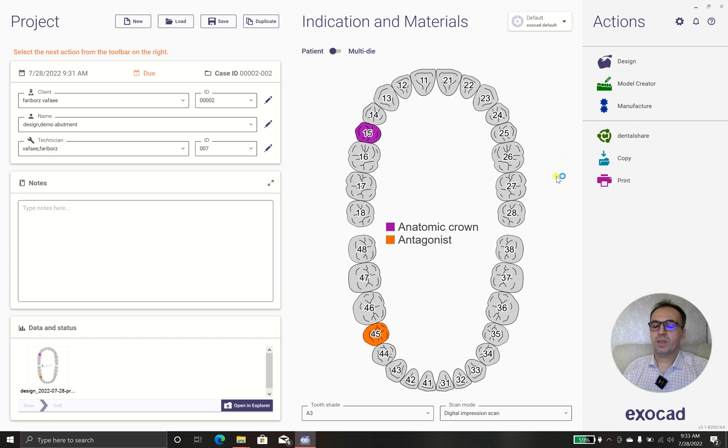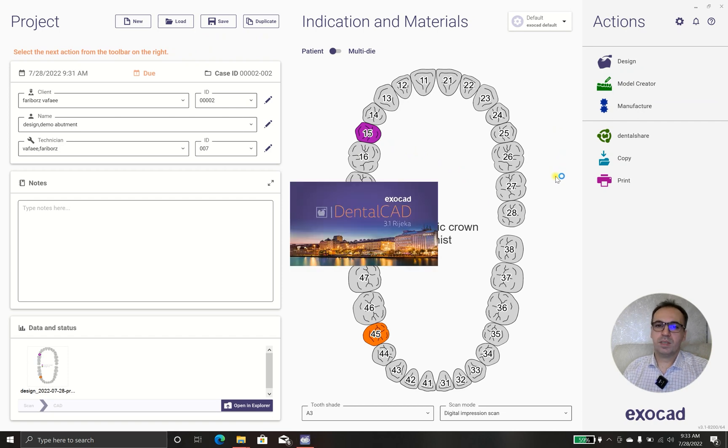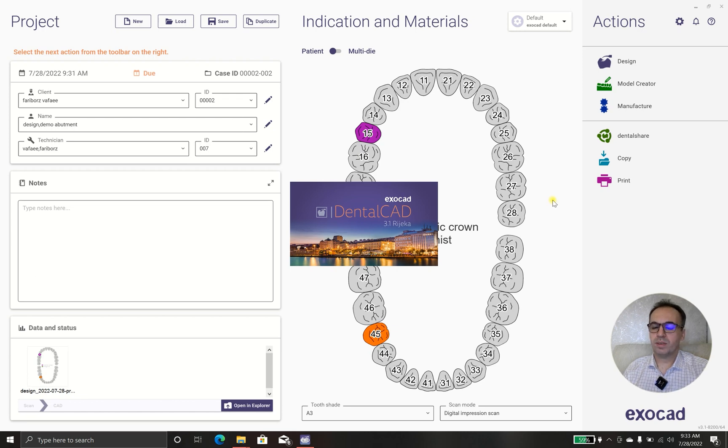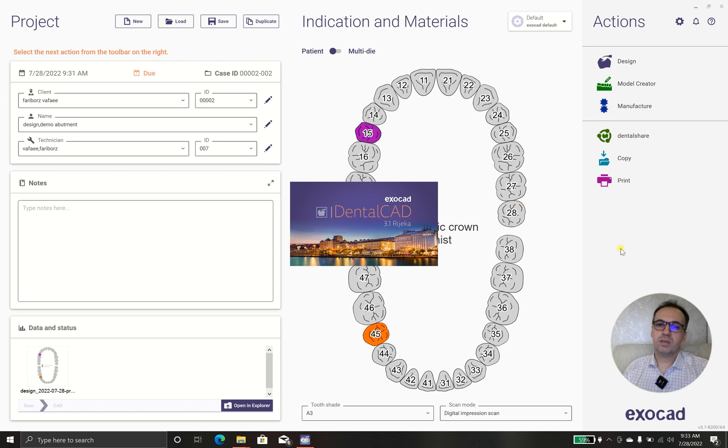We are using exocad 3.1, the latest version of exocad that is released. And let's see in case that there is any change with 3.0 and 3.1.